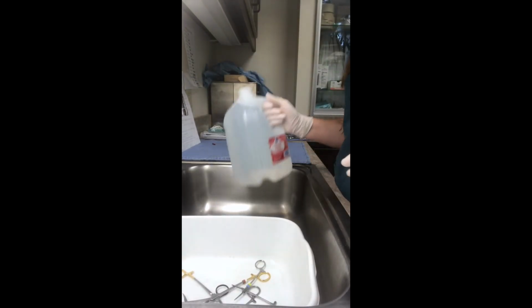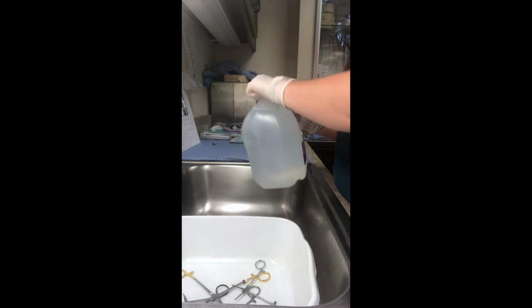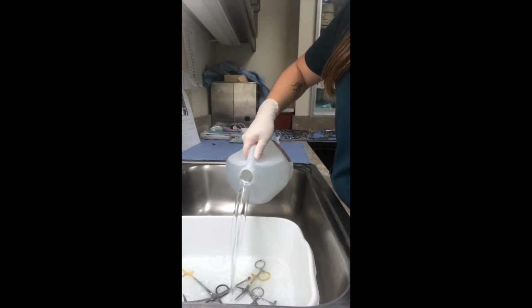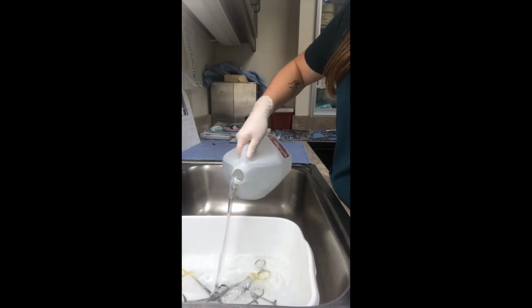I'm going to demonstrate how to pre-soak and pre-clean our surgery instruments. We're going to use distilled water. We have a distilled water jug here. We're going to go ahead and put that over our instruments.